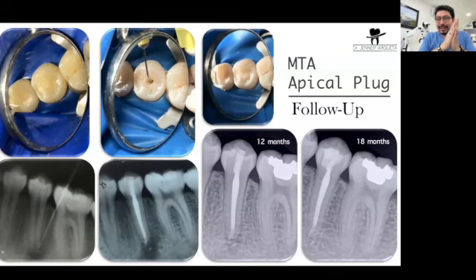And the microscope is a tool that mostly will provide most of the benefits to the dental practitioner. And we will see why. We will start with that. The microscope is a tool for you guys. If you are dentists, you are going to buy the microscope because of you. And then you are going to provide all the benefits and transmit all those benefits to the patient, because it will enhance your ergonomics. It will provide you a clinical environment in which you will be relaxed.